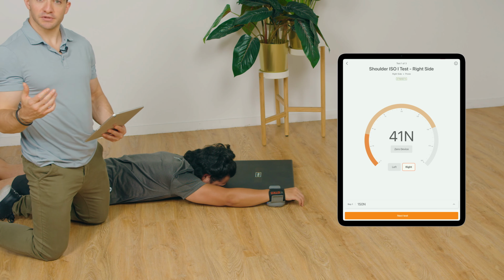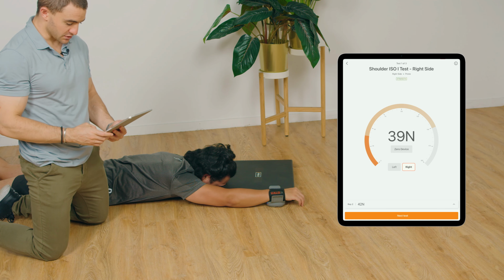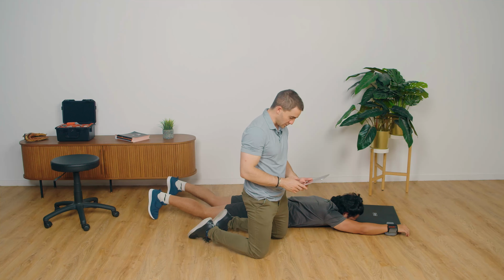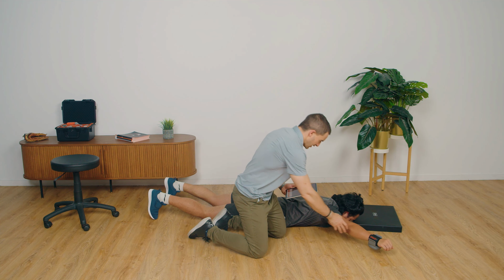Now we can do that multiple times depending on how many reps we want to collect. I will delete any aberrant reps. Let's go on to the next test. Cal, go into the Y position when you're ready.